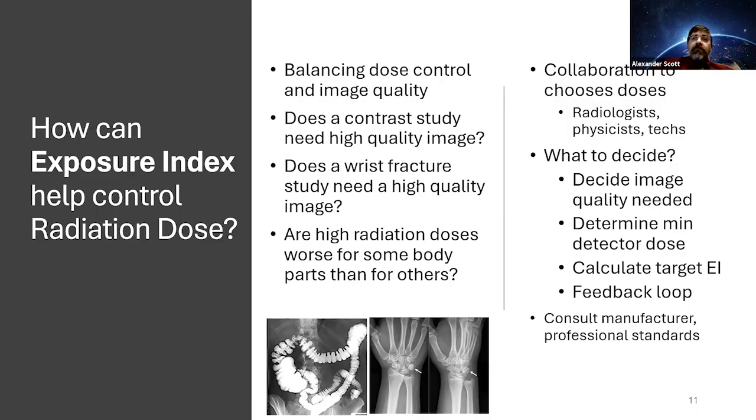And because the abdomen has a number of organs that are highly radiosensitive, that's a really good place to cut down on our target dose to spare the patient the concern about cancer. So, how do we decide on this?